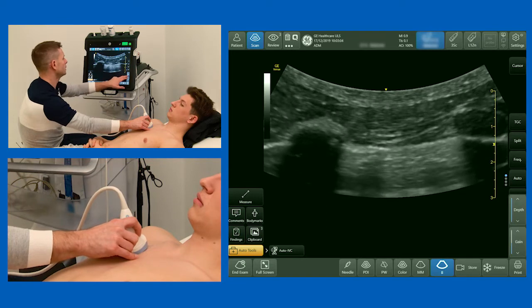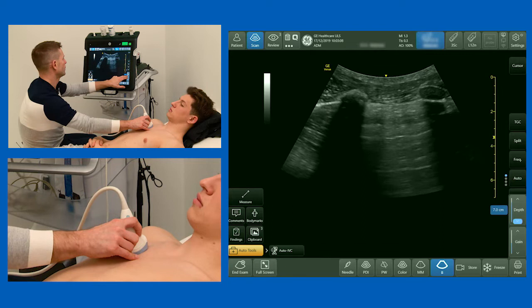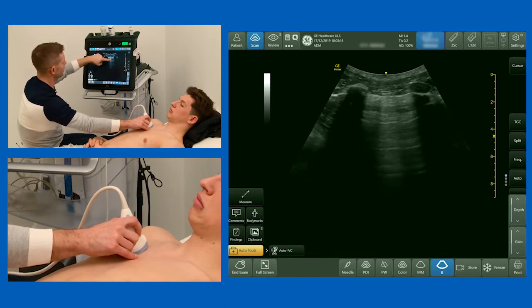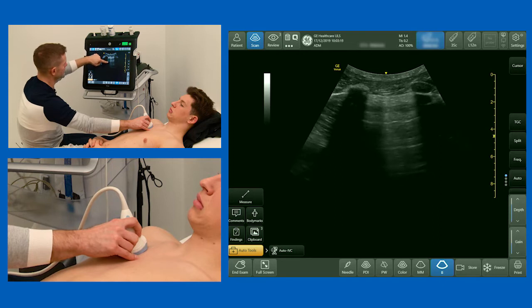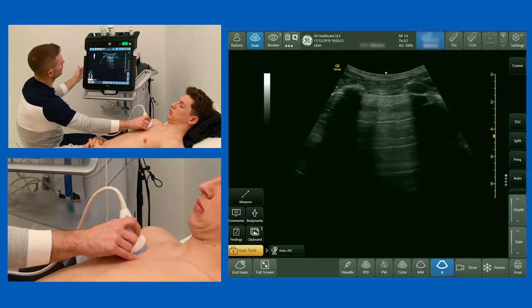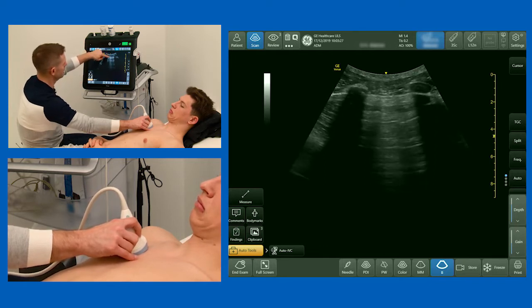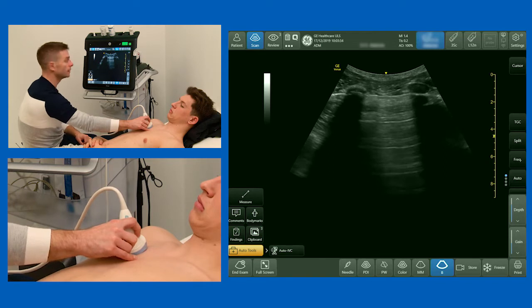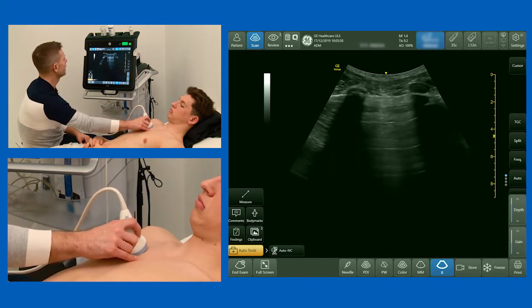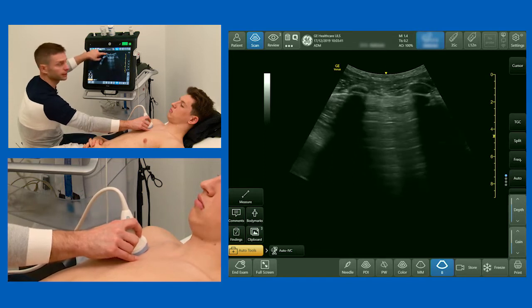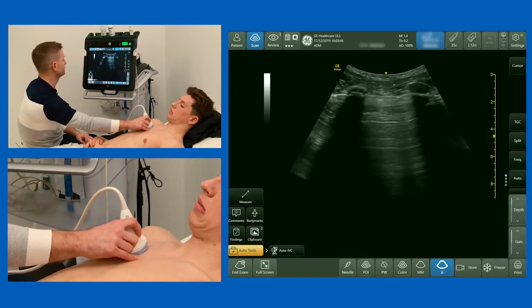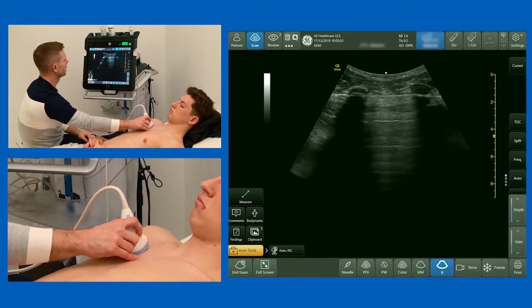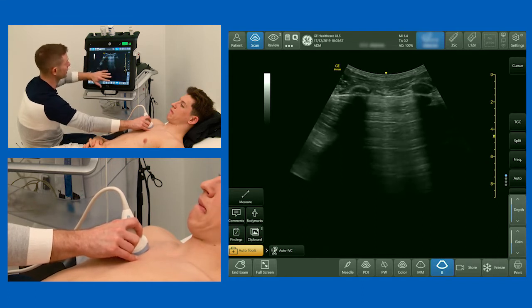After we've identified lung sliding, we can drop our depth a bit more and look for artifacts called A-lines. The pleural line is the top white line, but we can see other white lines repeated down through the image. What's happening is the sound waves come down through the soft tissue and hit the pleura. Because there's air underneath the pleura, soft tissue and air conduct sound waves at very different velocities. All of those sound waves are reflected back to the transducer, meaning we can't actually visualize the lung — all this grey stuff is artifactual noise.